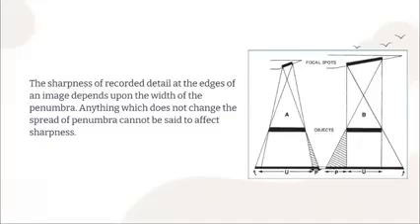With all other factors constant, the smaller the focal spot, okay, the sharper is the recorded detail in the image. The focal spot is inversely proportional to image sharpness. As you can see in the image, di ba? Focal spot, pag gamay siya, lesser ang occurrence sa inyong penumbra. Pag dako inyong focal spot, which is kanang kung asa mag-strike ang x-rays, dako inyong penumbra. Okay? When this happens, sharpness of the detail is decreased. Pag small focal spots yung gamit, sharpness is increased, recorded detail is increased.